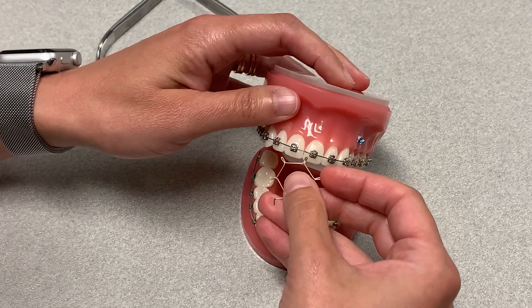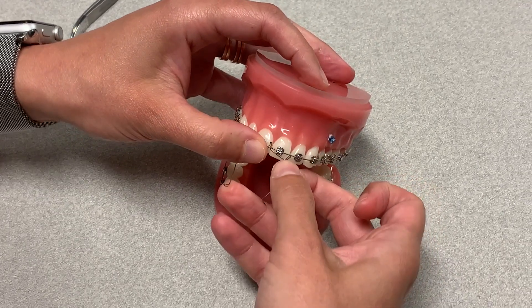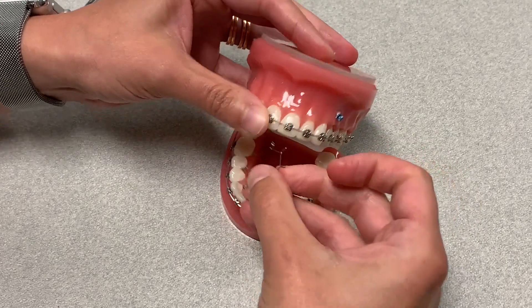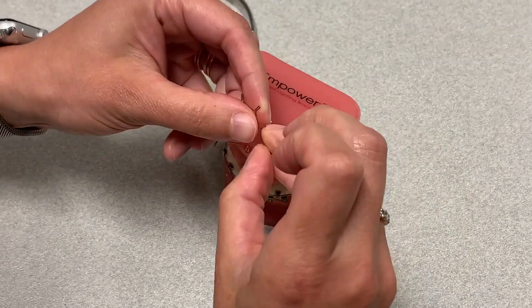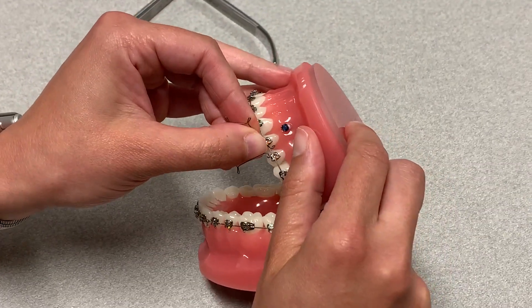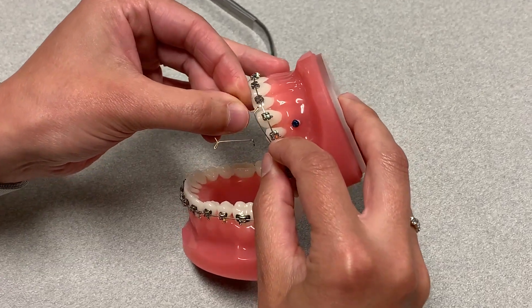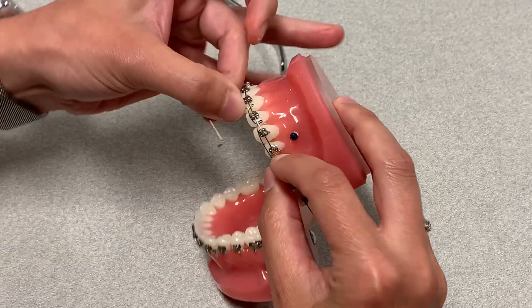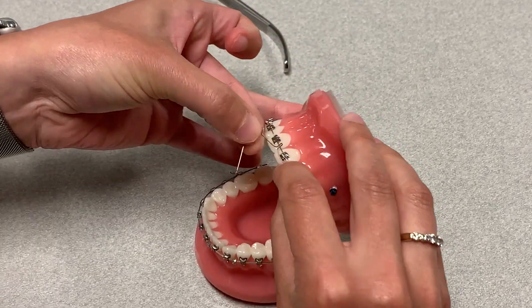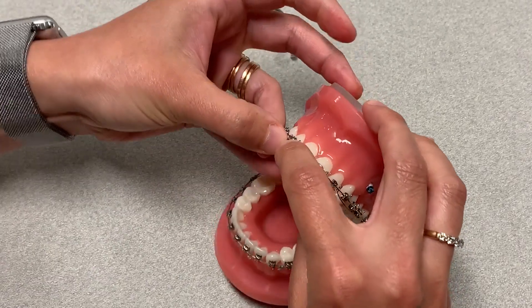Once this is installed it's going to look like this. For the uppers, you always hook distal to the fours — so one, two, three, four — we're going to hook right here, and it's going to skip two. Then you just unwind it, and here we are with our central that has that little bit of a bend in there, and you just keep unwinding.